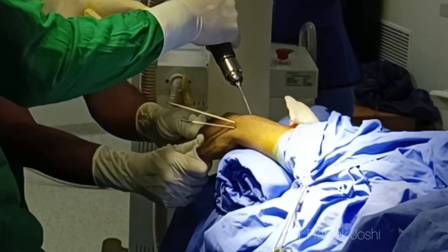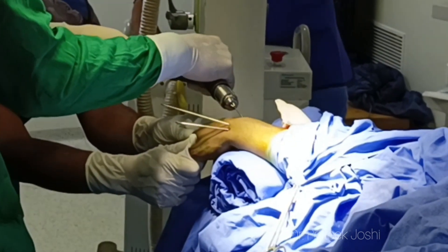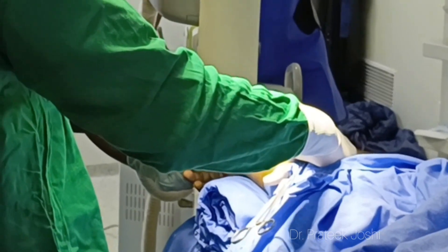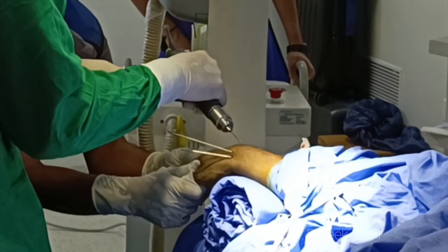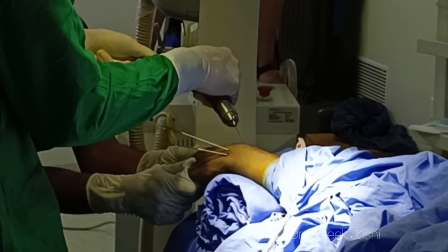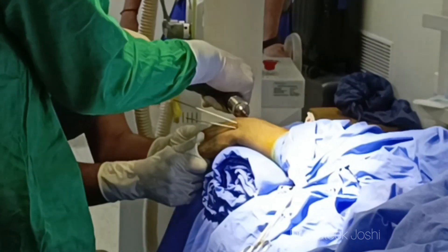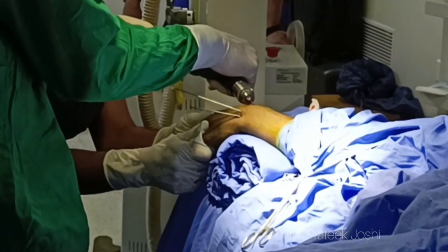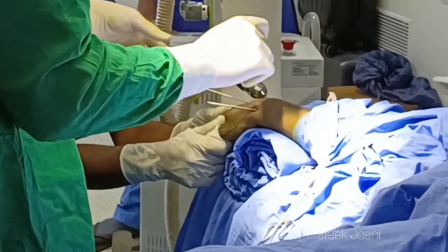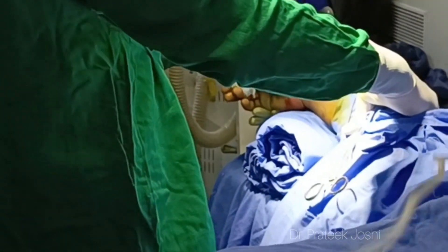Now I am going to insert another K-wire from the dorsal aspect of the wrist, over the most ulnar side of the distal radius, to engage the medial-most fragment of the fracture. I have palmar-flexed the wrist to make it easy to find the correct entry point. The EPL tendon is at risk here if the correct entry point is not identified. The trajectory of this wire is from the ulnar to radial side and from dorsal to palmar side.